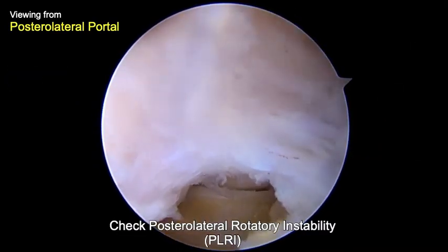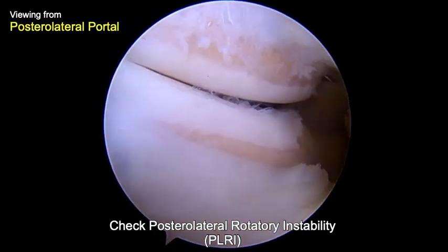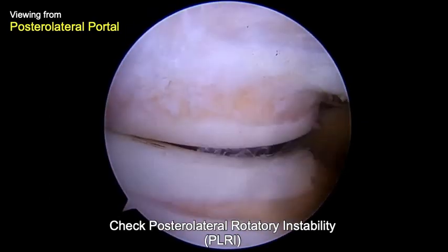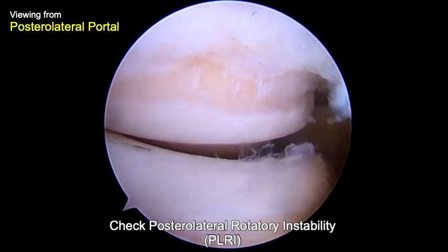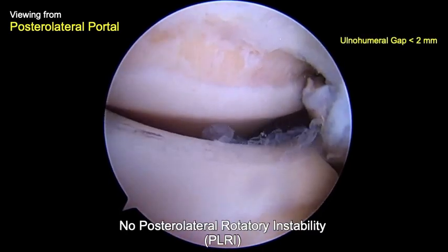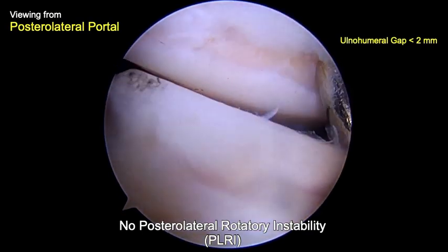After finishing the debridement procedure, the posterolateral rotatory instability of the elbow was checked. Viewing from the posterolateral portal, a probe from the direct lateral portal was used to measure the ulnohumeral gap during forceful supination of the forearm and full extension of the elbow. A widening gap of more than 2 mm indicates the presence of posterolateral rotatory instability.